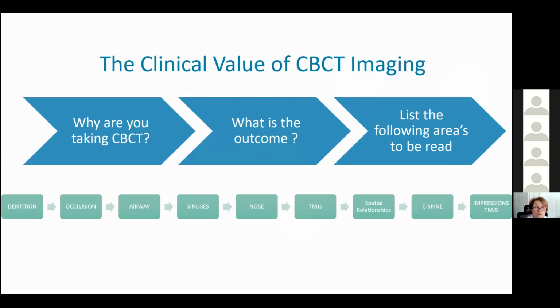So the clinical value of a CBCT scan and the imaging program is, why are you taking that CBCT scan? So knowing your patient's reasons they give you and taking your clinical gives you enough of a reason to order the CBCT scan. What is the outcome of that CBCT scan? If you've learned how to read all of this, that's great. Then document it. But I know that most dentists, I hate to say this, do not document why they took x-rays and what the x-rays show. They just tell the patient, this is what you need, but never why you need it.